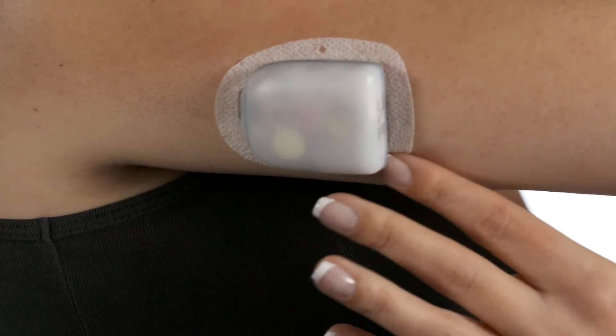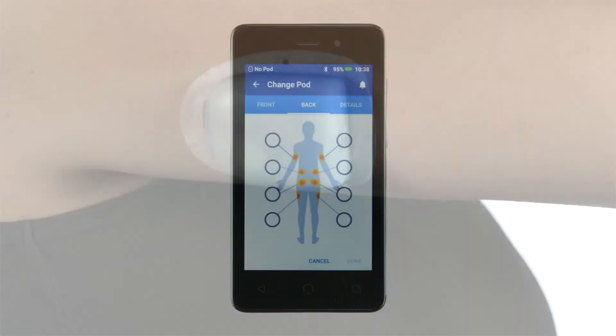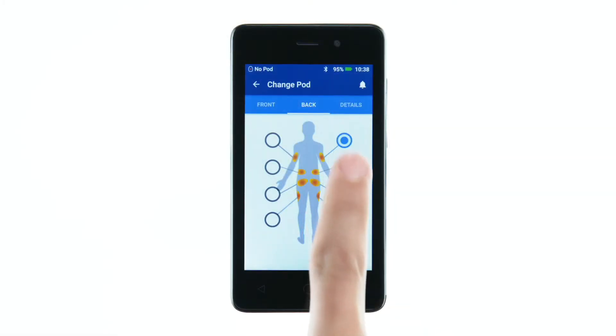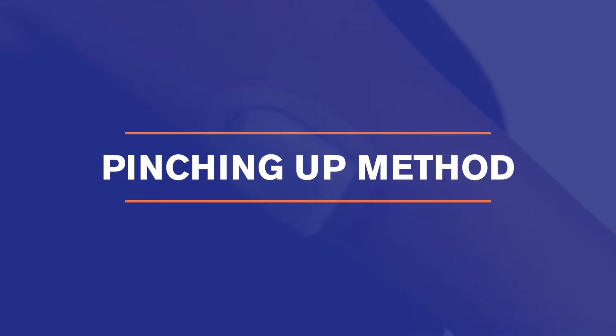After applying the pod, the next step is for the pod to insert the cannula under the skin. If you selected an infusion site area that is lean, consider using the pinching up method to ensure successful cannula insertion.